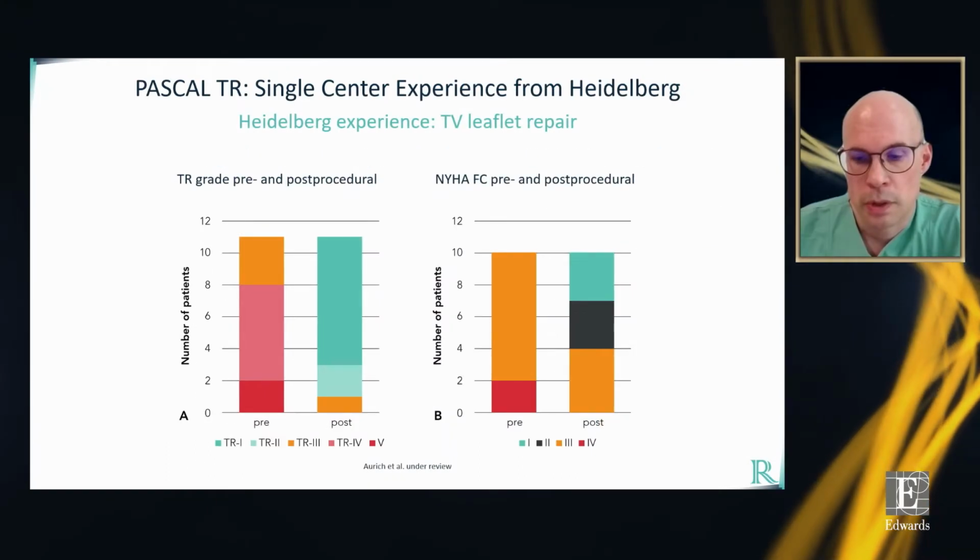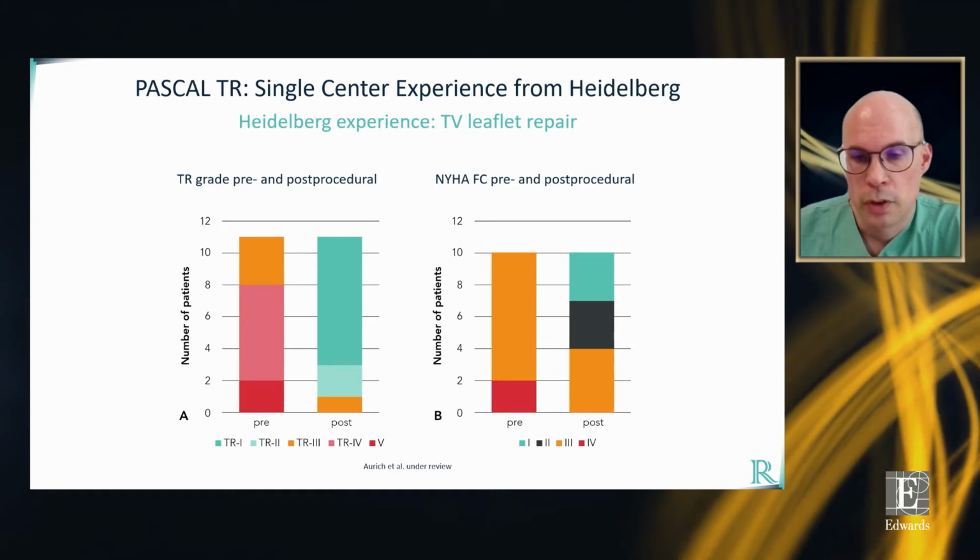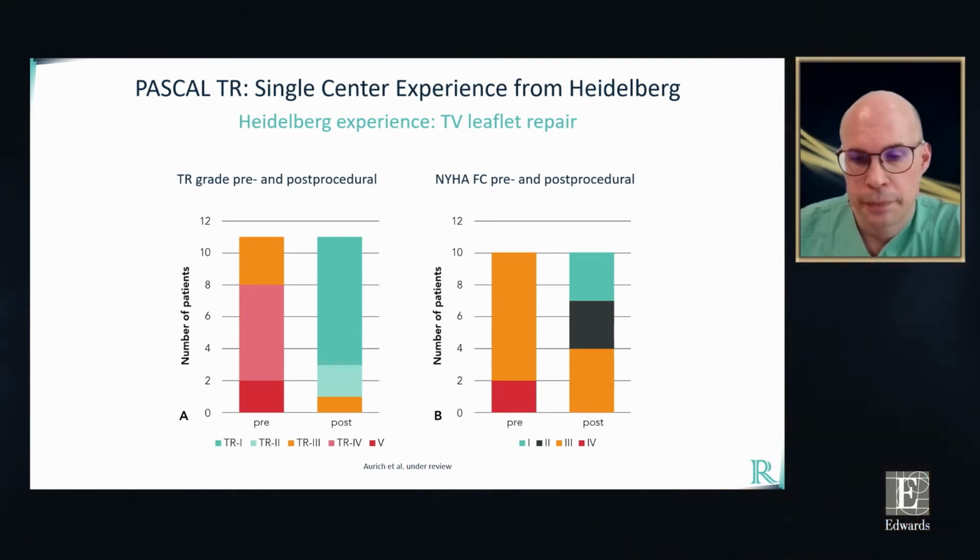And this corresponds, on the right side, to NYHA class. The NYHA class was fairly reduced in these patients using the Pascal ACE device.